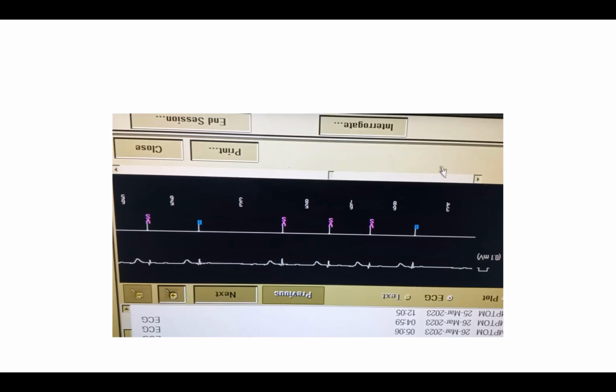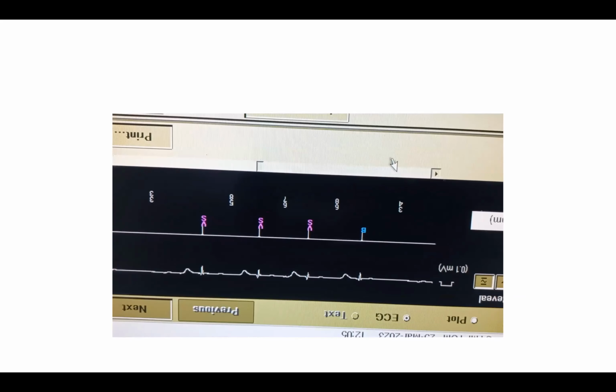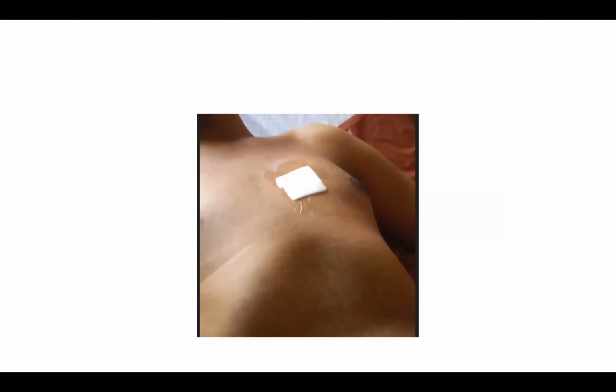Then the other issue, this one we are taking when I was doing analysis with Julius. So this one is also another patient. We usually follow the same look. This is after the recording. So we put a betadine gel, betadine ointment. I know you may not be doing that in the UK.